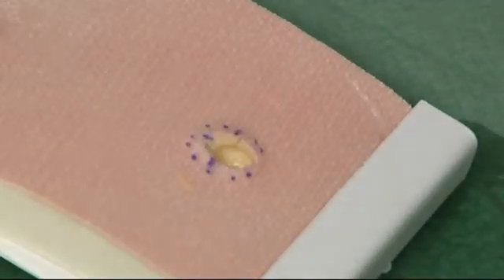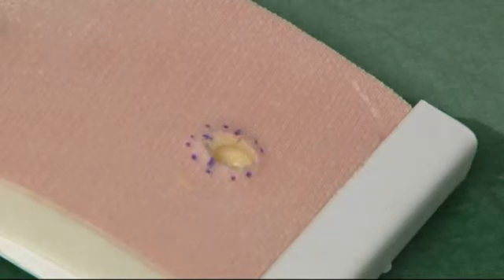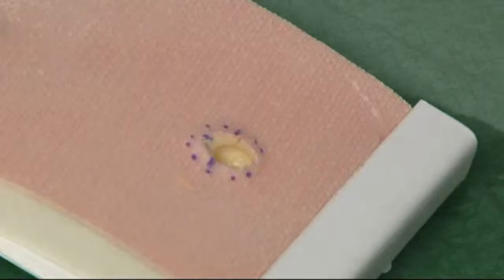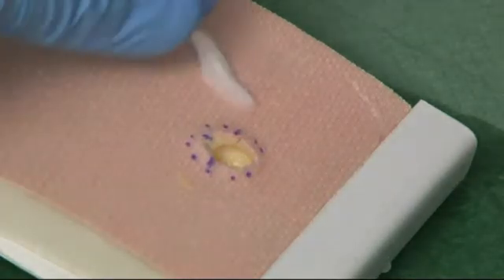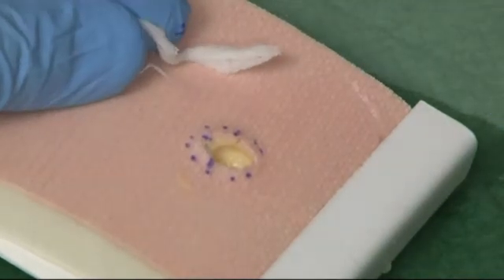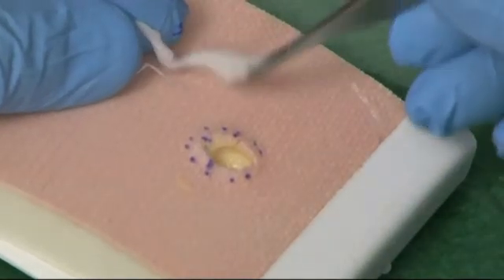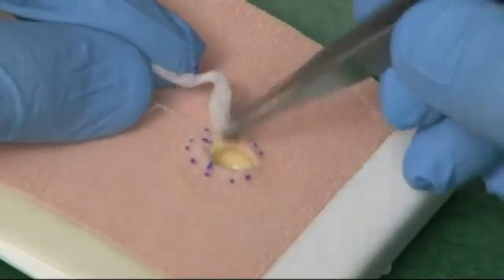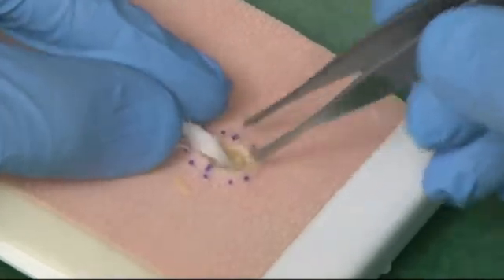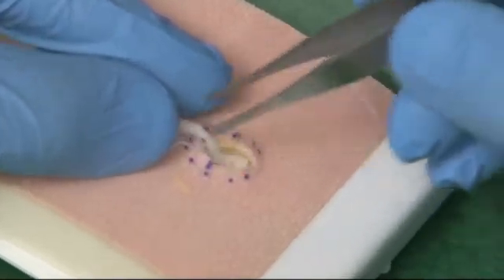Lightly fill the cavity with a small piece of jello net. This will prevent the cavity walls from collapsing and adhering together. Try to avoid tight packing as this can cause ischemia of the surrounding tissue and impede drainage of the purulent material.